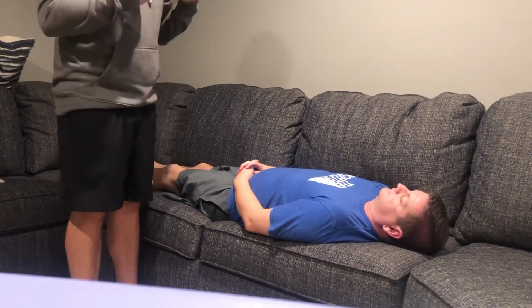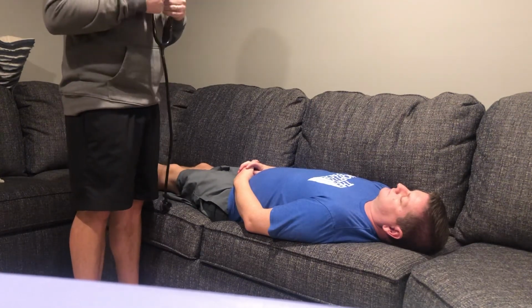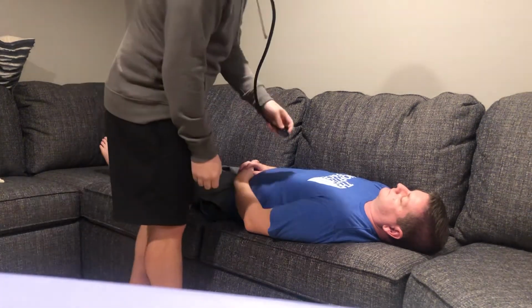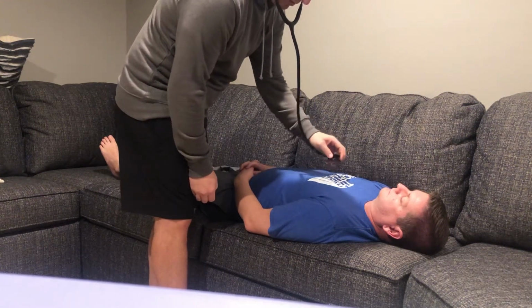No. Okay, first thing I'm going to do is auscultate your heart sounds. I'm going to listen with both sides of my stethoscope. We'll first do it in the supine position, followed by a left lateral position. So I'm listening to heart sounds. Initially, we're listening for the aortic valve, second intercostal space, right sternal border.